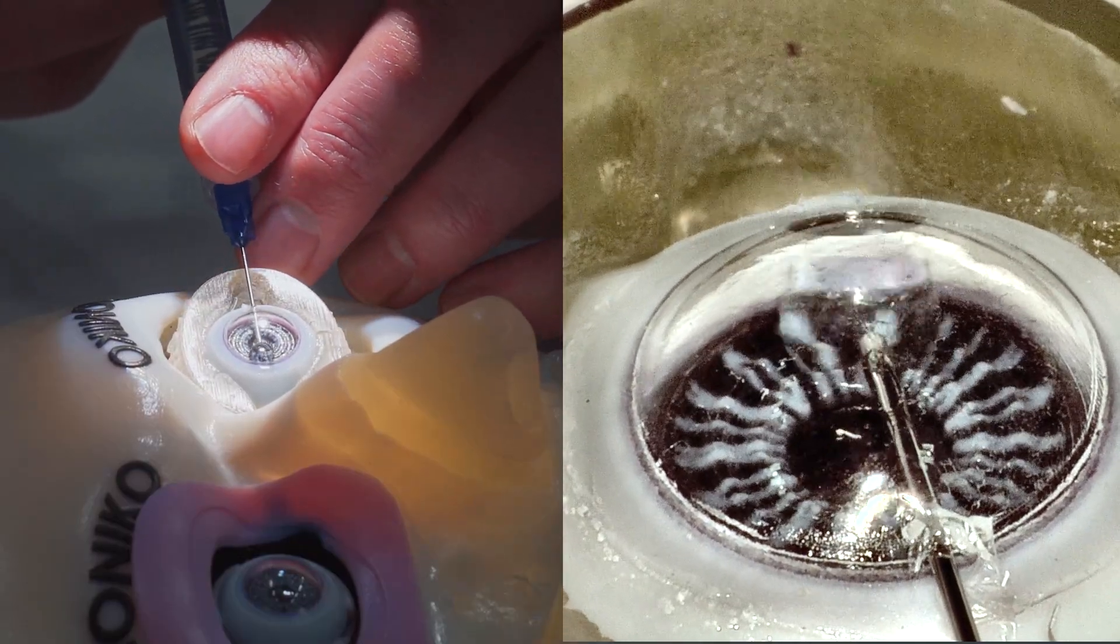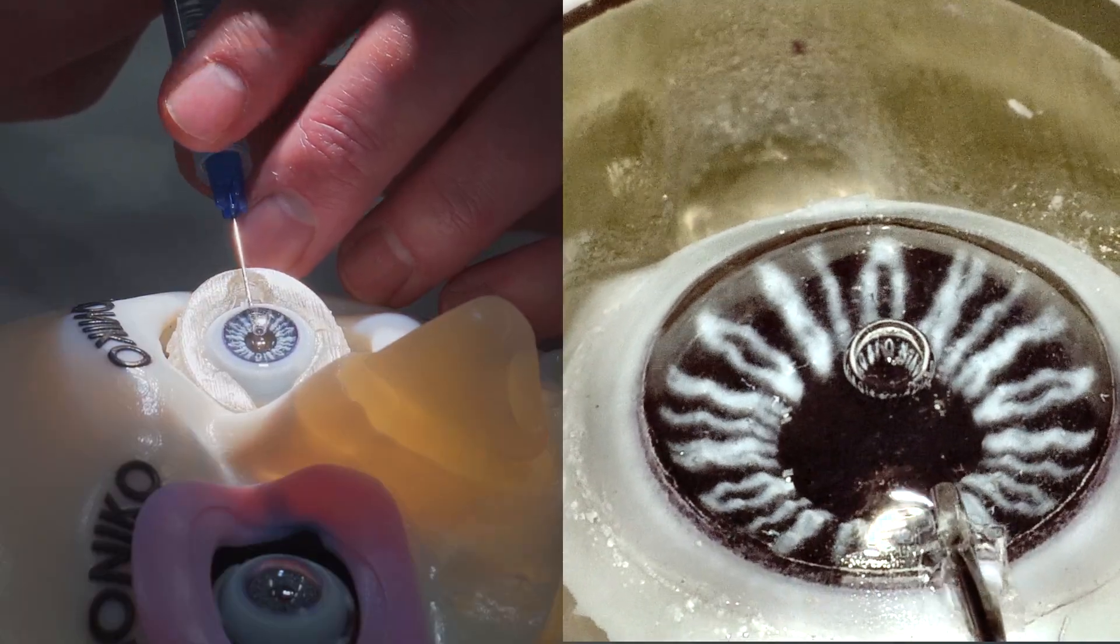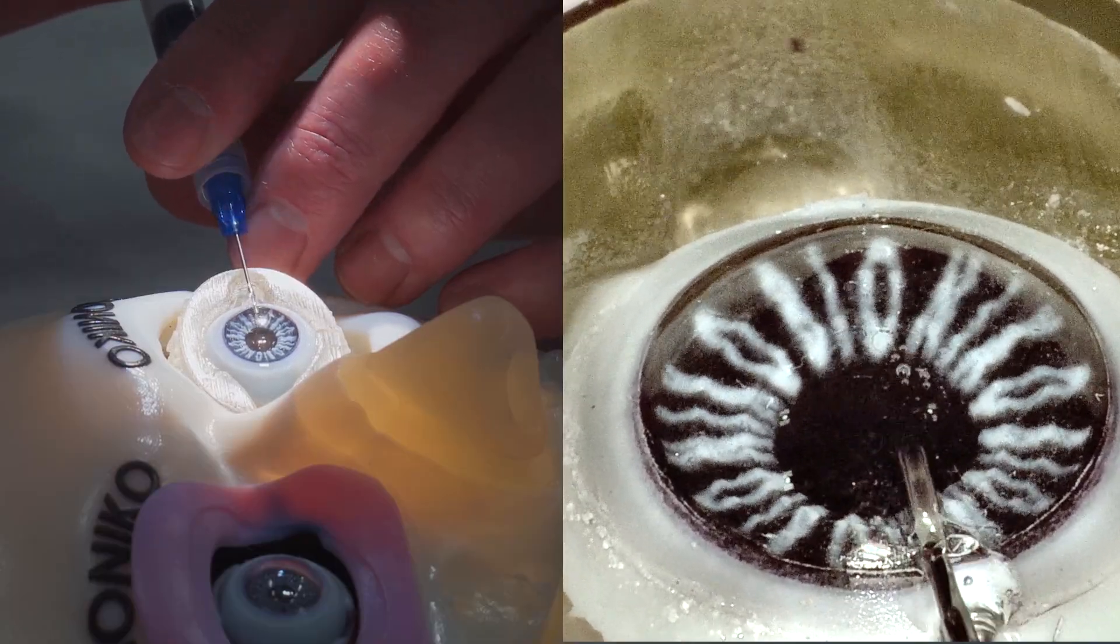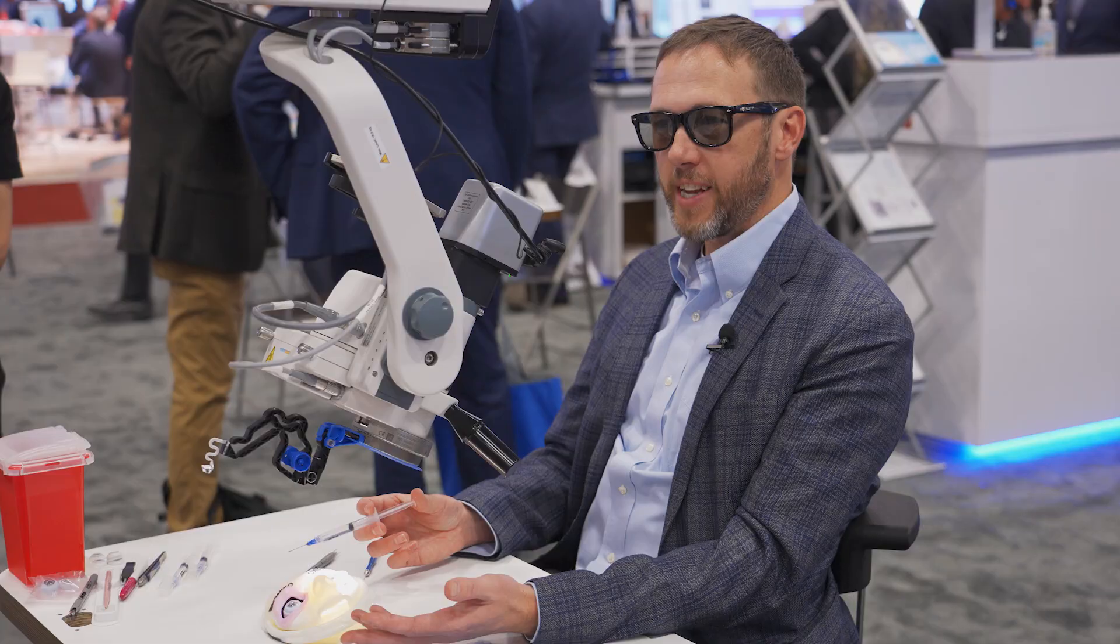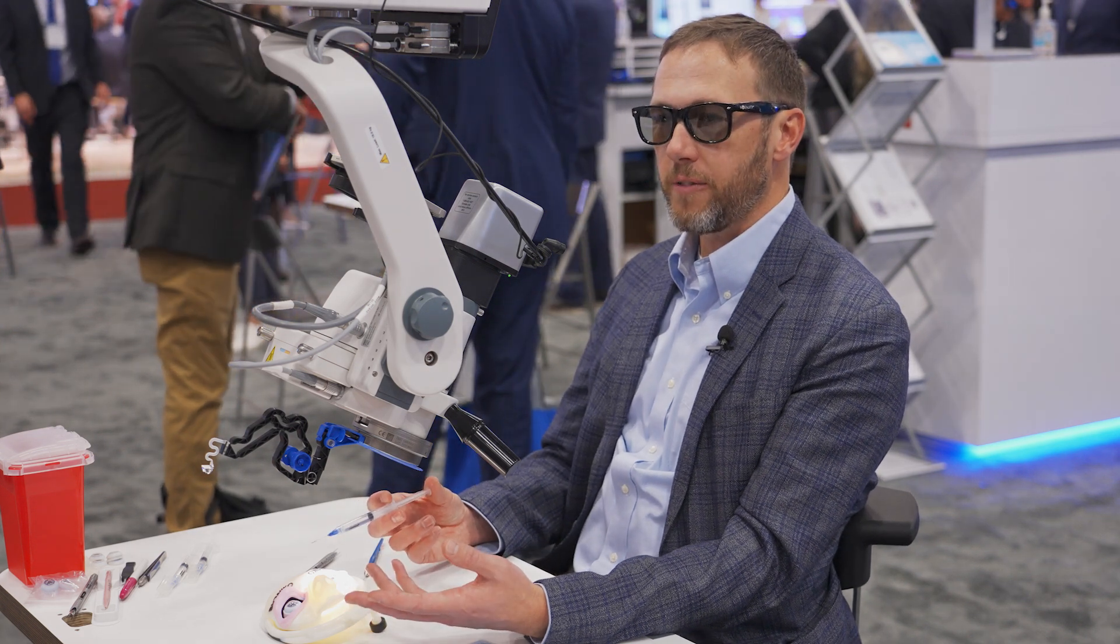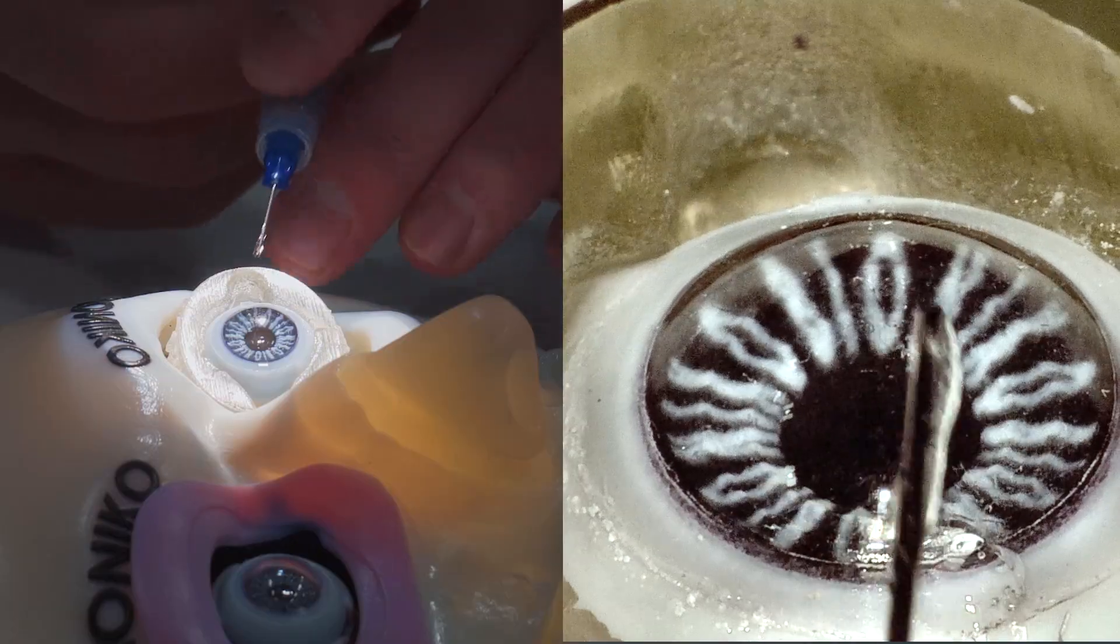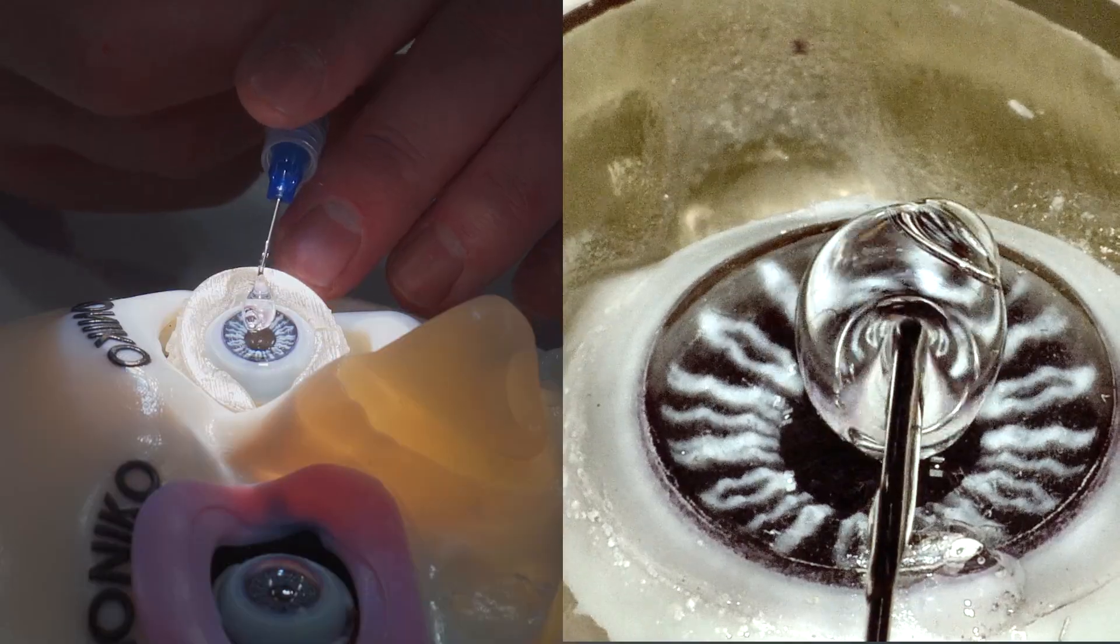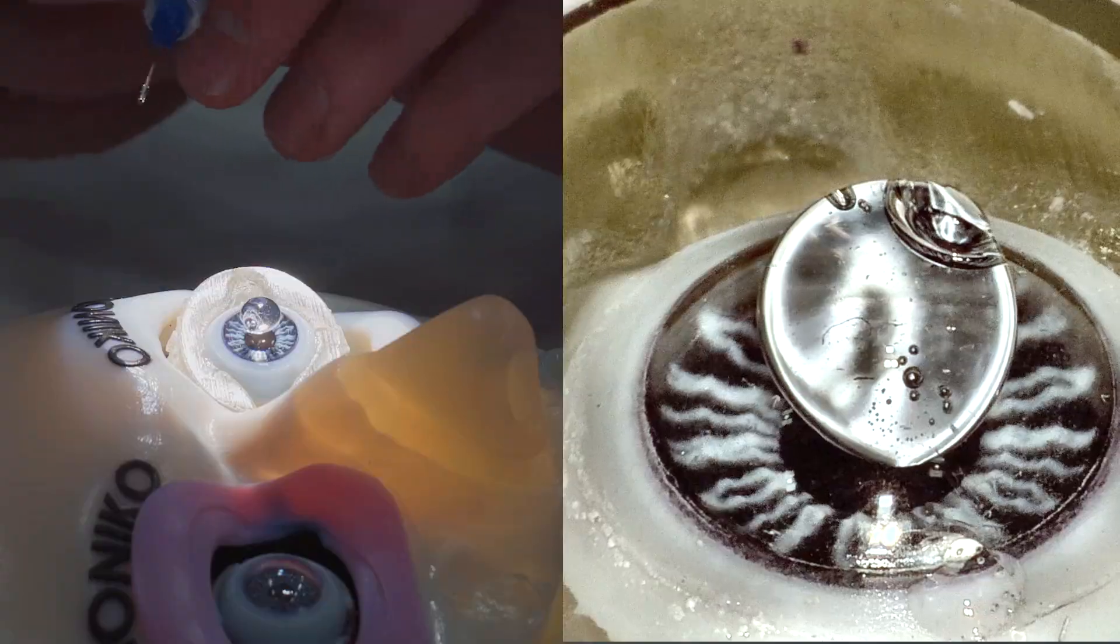For any angle procedure, you want to make sure you have a nice fill in the anterior chamber. If you underfill, you're going to see a lot of striae; it's going to make visualization more difficult. If you leave a bubble behind like I just did, that's going to make it more difficult, so we're going to get that out of the way. At this point, you're going to rotate the patient's head. Once you get the AC filled, you're going to rotate the patient's head about 30 to 45 degrees away from you, and then rotate the scope about 30 to 45 degrees towards you. Then we're going to put a nice dollop of viscoelastic on the cornea, and that's just going to be our coupling agent.